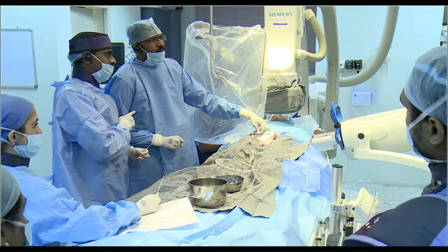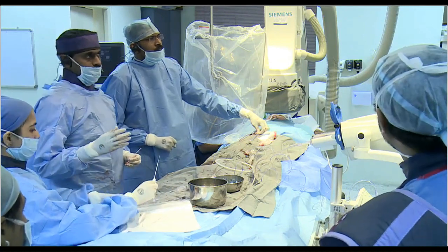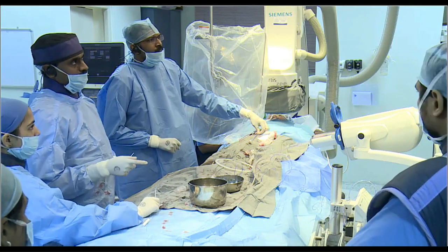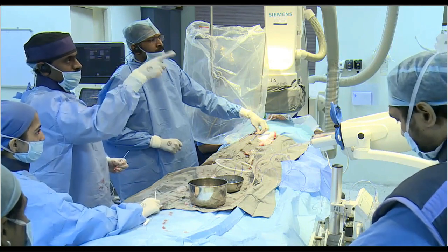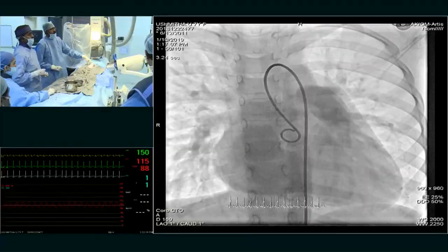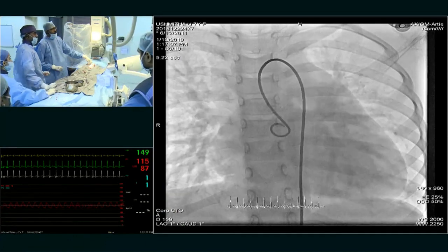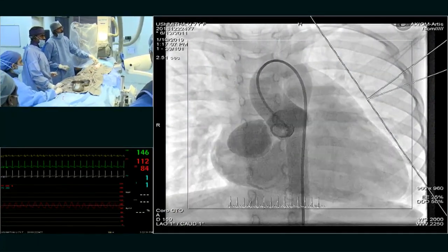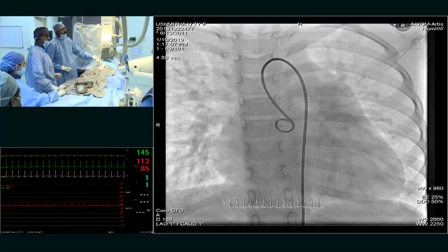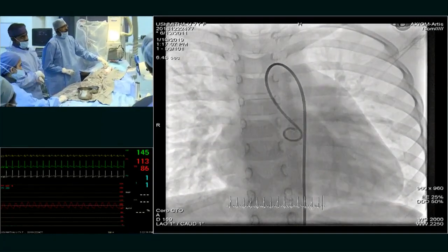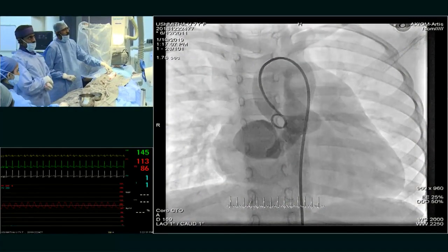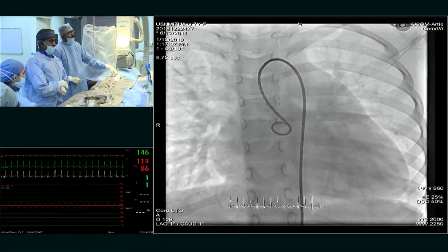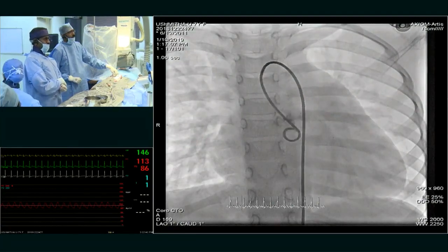Most of the work has been done by Dr. Avinash, my colleague, in the last about half an hour. So this is the coronary AV fistula — going straight to the picture. This is a seven-year-old girl who has a large heart, a continuous murmur in the right sternal border, a large coronary fistula arising from the proximal right coronary artery, entering into the right atrium, causing diffuse chamber enlargement.